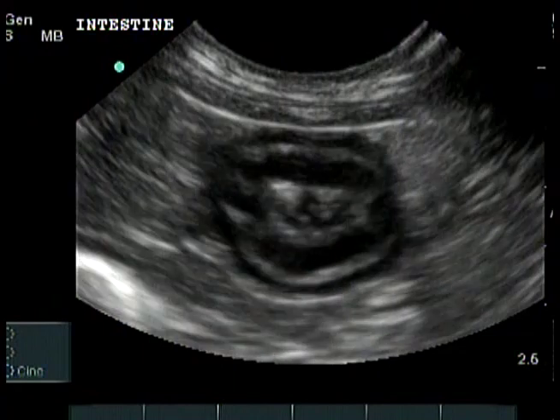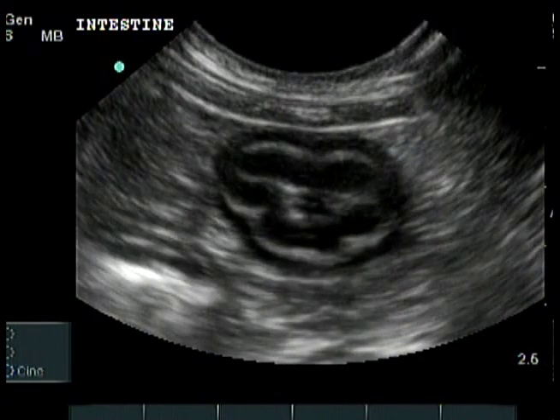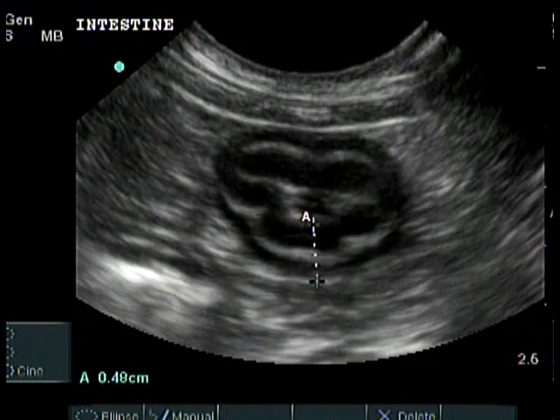This video is a short axis view of a nearly empty cecum from a 12-year-old Dalmatian with fever and anorexia due to hepatic lymphoma.